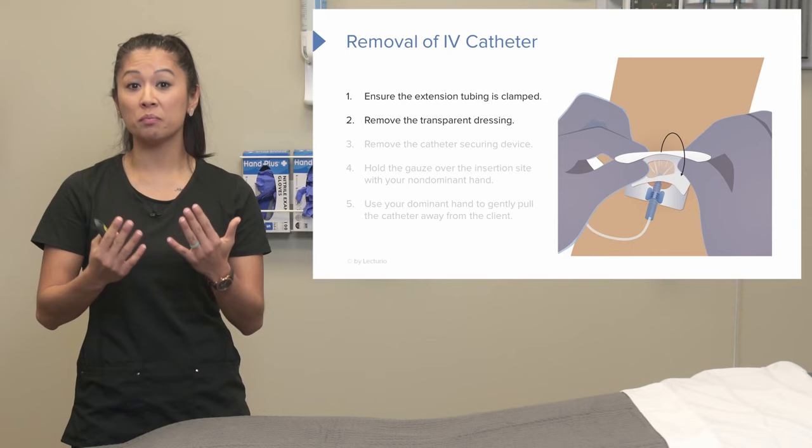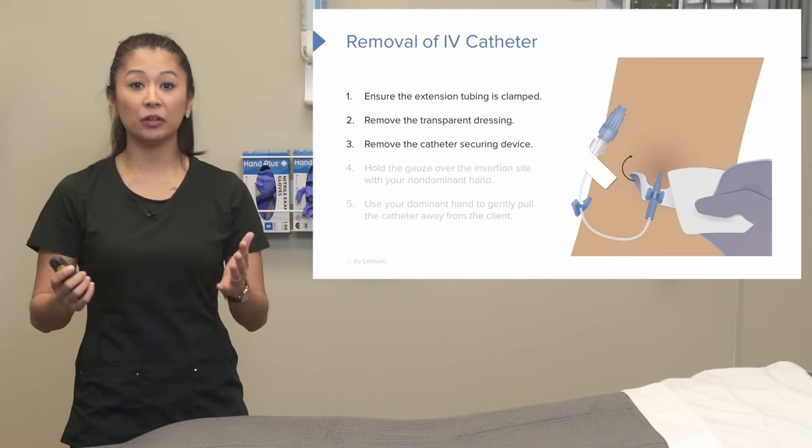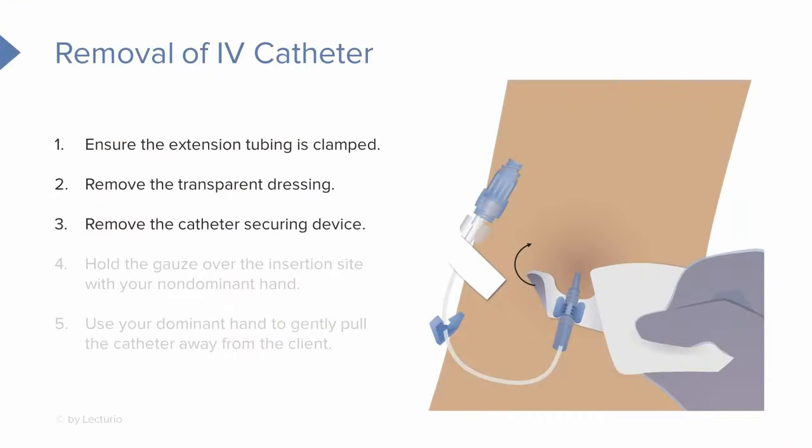We can slowly remove that transparent dressing. And if your facility uses a catheter securement device, we're going to take that off at this time as well.